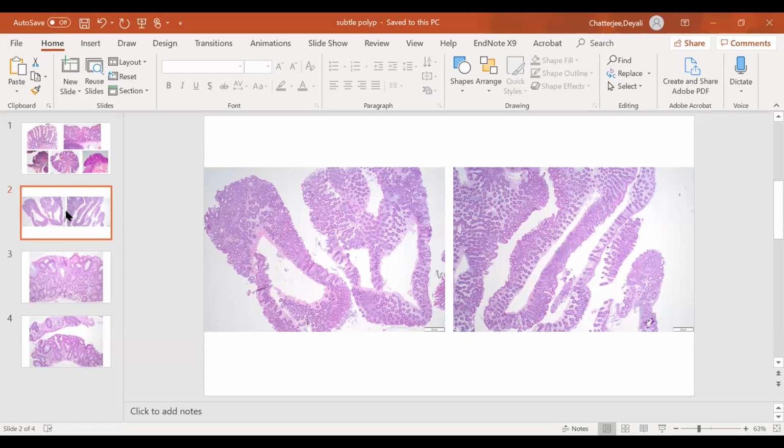You tend to make a diagnosis that is either indeterminate or makes the pathologist confused. And just like what you just said, we actually don't have a good, properly tangentially cut specimen that we can make the diagnosis from. But please take a look at the last paper that I put in the chat. Try to follow the way it should be done.